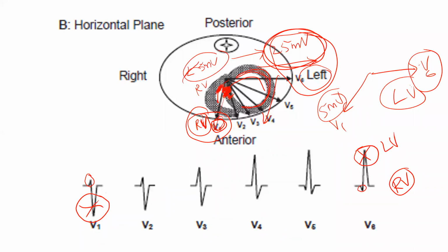So, this small positive wave in V1 and small negative wave in V6, these are the activity of RV. Now, LV activity is by this one and this one. Okay, if you just observe this ECG now of the waveforms, with one of the very important concepts we have, how do you explain the negative wave in V6? That negative wave in V6 is due to activity of RV.